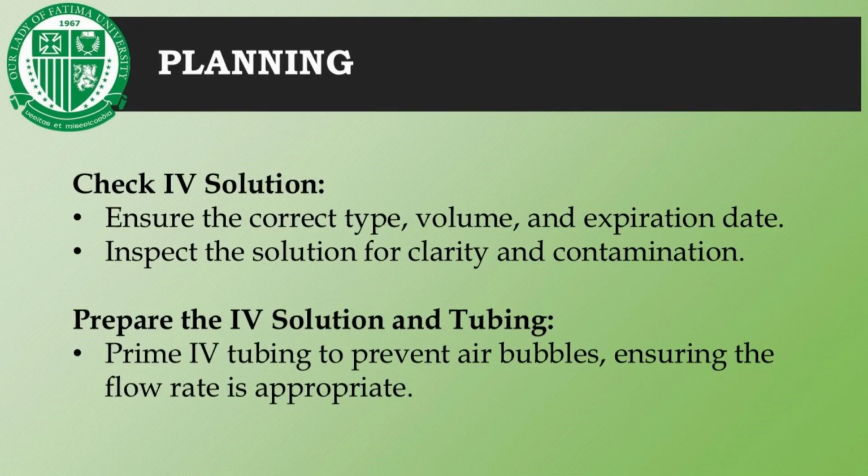Remember that the nurse should check the IV solution, ensure the correct type, volume, and expiration date, and inspect the solution for clarity and contamination. In preparing the IV solution and tubing, it is essential to prime the IV tubing to prevent air bubbles and ensure that the flow rate is appropriate.